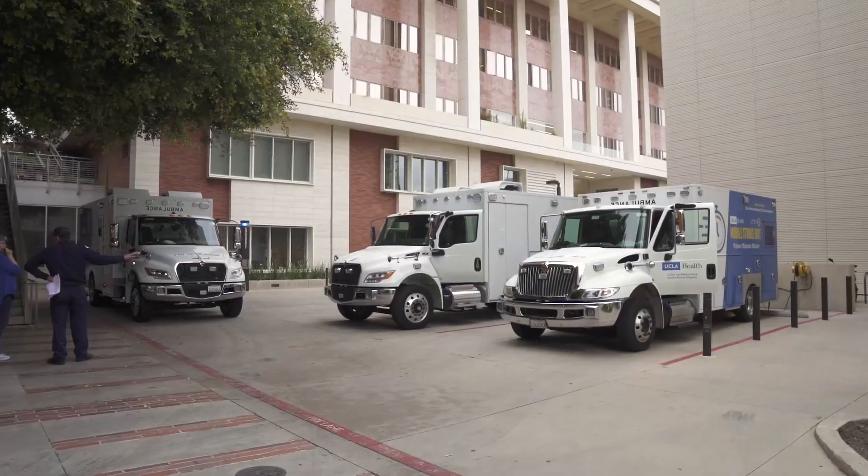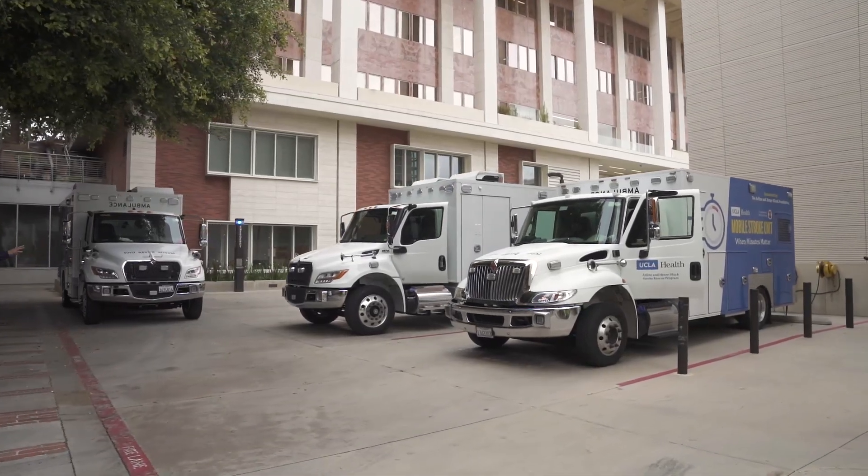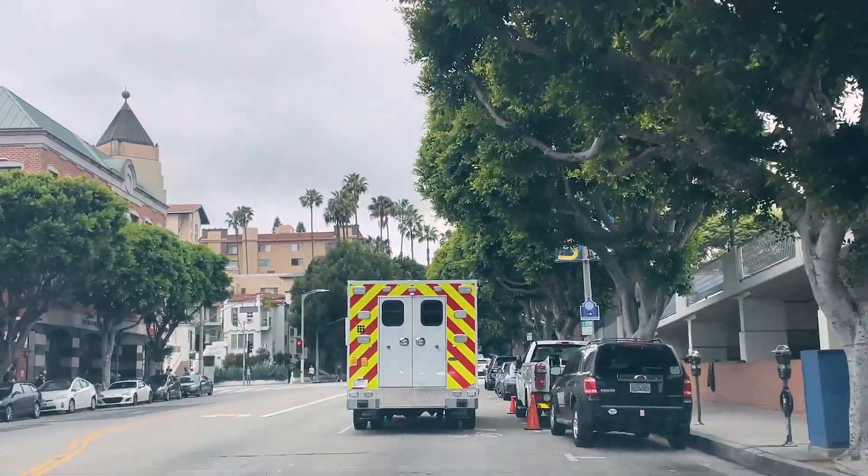Hi, I'm Laura Tangren, VP of Business Development for Fraser. We're here with our 28th Mobile Stroke Unit. UCLA will be running three Mobile Stroke Units in the Los Angeles area, and this is one of those three.